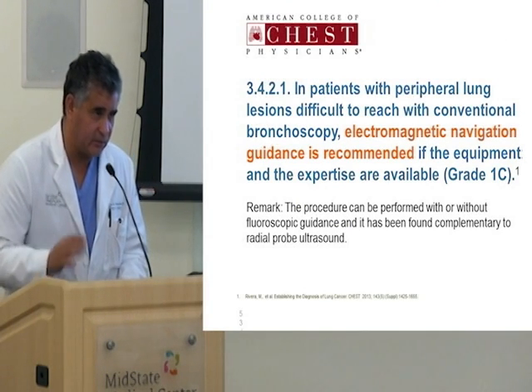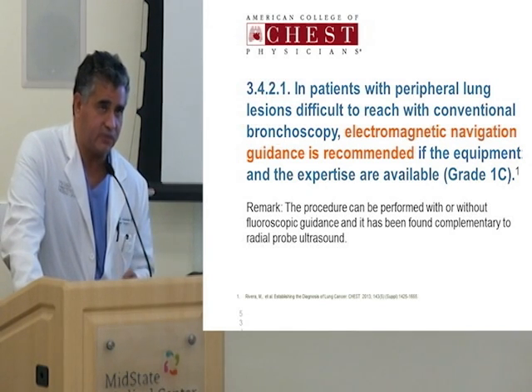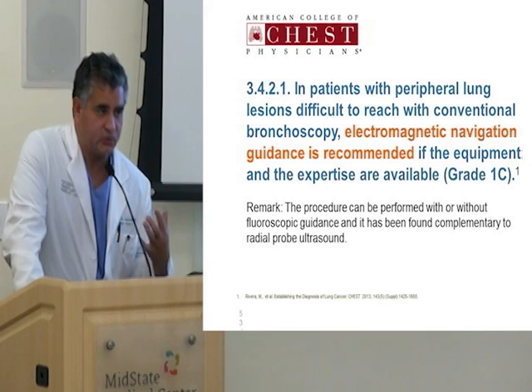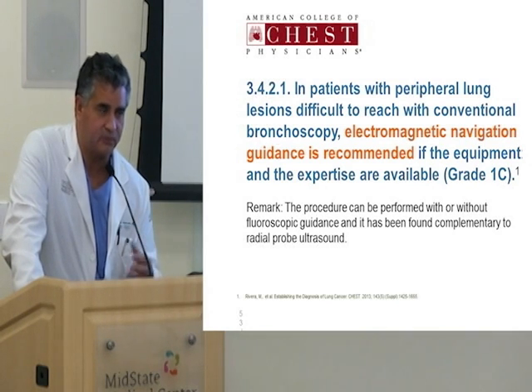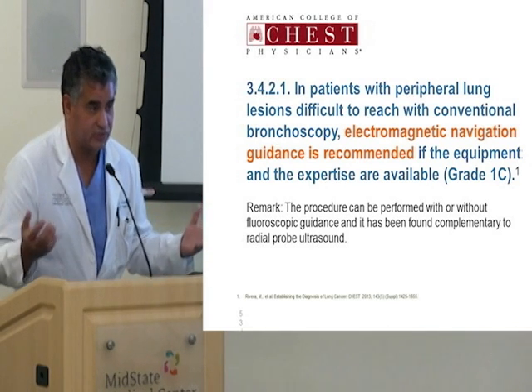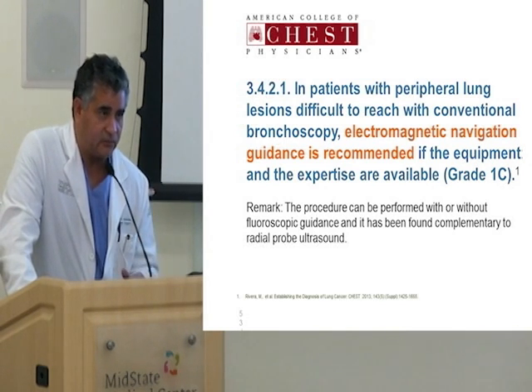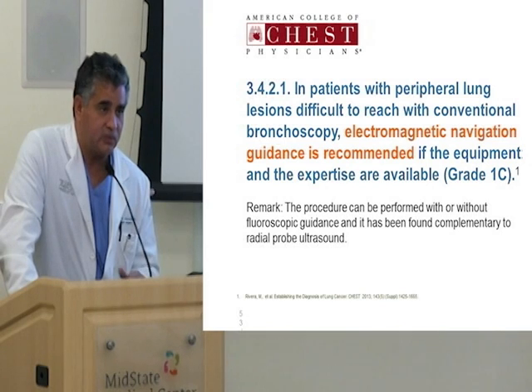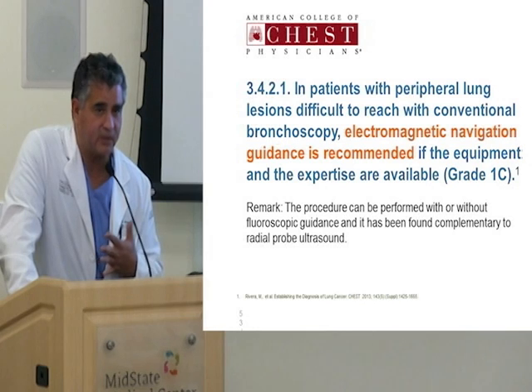And I want to show once again these two recommendations from the American College of Chest Physicians, because in many ways, I think every time we in medicine are introduced to a new technology or a new modality, there's always a healthy skepticism as to whether or not we should really adopt this fully. And I think now we're moving to a point where big organizations are trying to direct us. This is a consensus statement from the American College of Chest Physicians that, with respect to CT-guided biopsies, that's a very good technology for certain lesions, but for many other lesions, we probably should start to consider navigational bronchoscopy, mostly because the complication profile is so much lower. I mean, it's literally an order of magnitude lower.